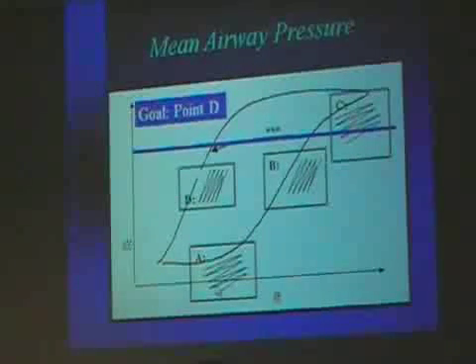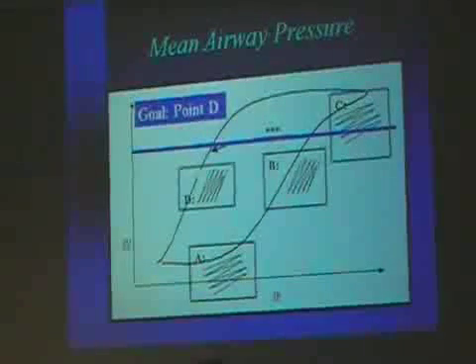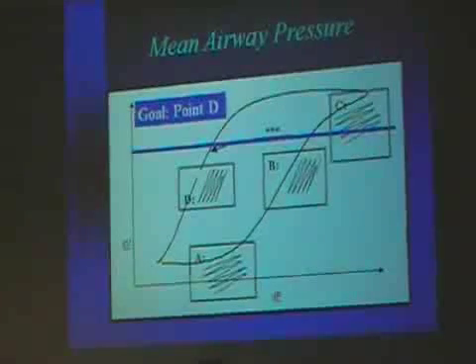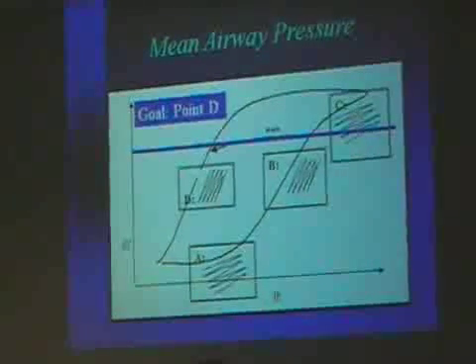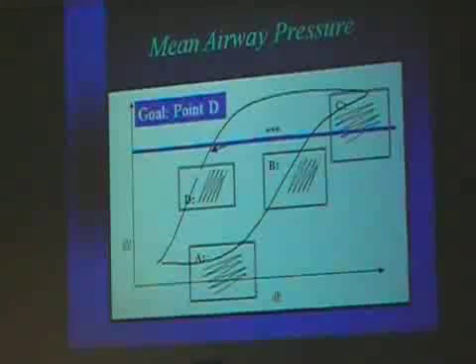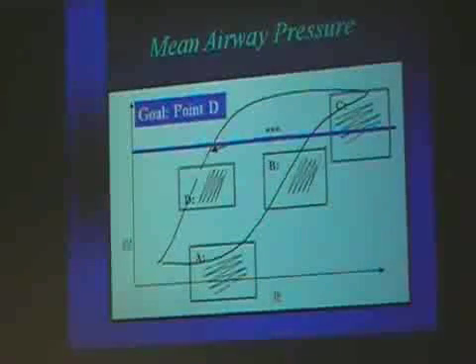This is what we do when we recruit the lung during high-frequency oscillation. And in fact, to correctly use the oscillator in circumstances where you're first putting a baby on, you need to recruit the lung, sit there at the bedside, go up on your pressure until you're just slightly seeing that your FiO2 is going up, and then walk back down again. There are multiple excellent articles showing how this can be done and how it needs to be done.